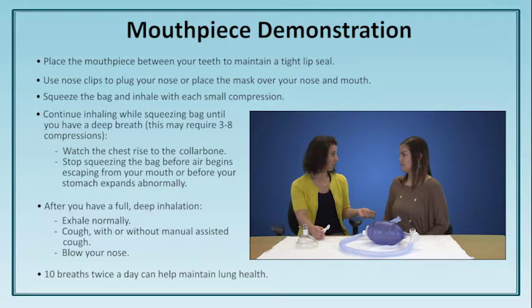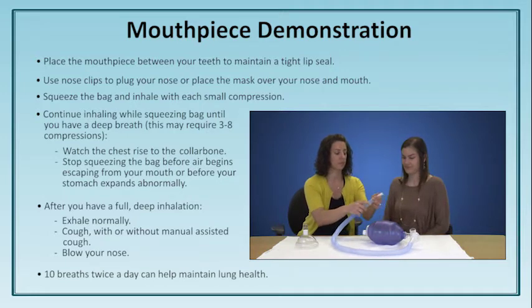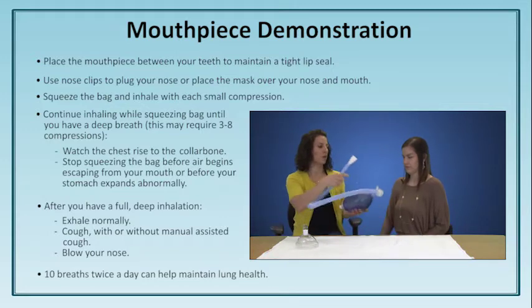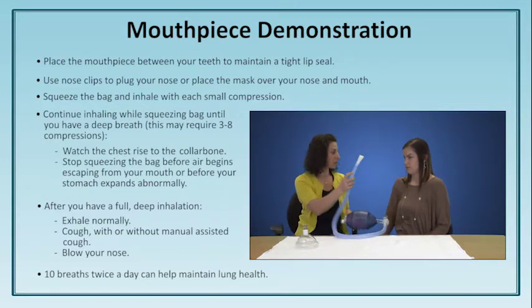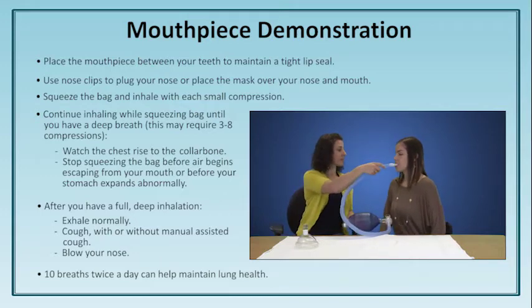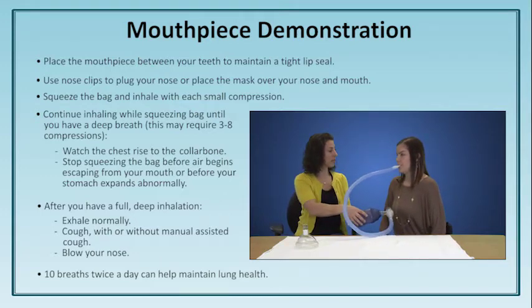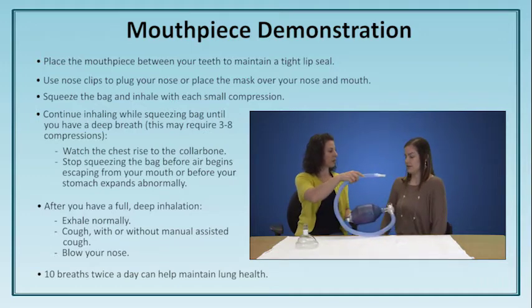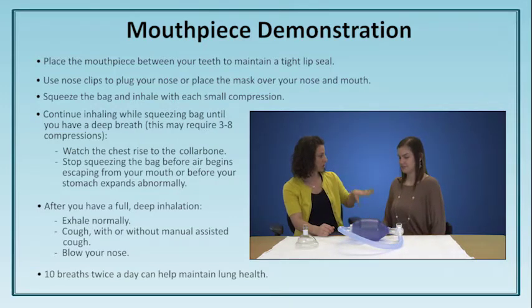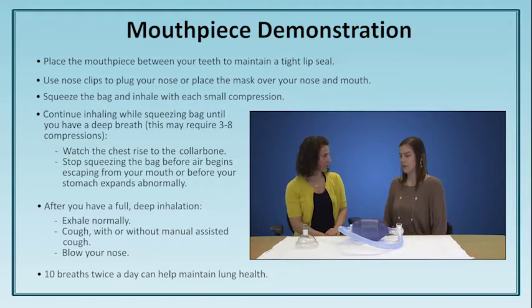Today we're going to try it without nose clips — if you need them you can add them. The indication for needing nose clips is if you feel air coming out of your nose. The mouthpiece goes into the end of the tubing here. You're going to hold the mouthpiece between your teeth and your lips, then just follow my instructions. Breathe in, breathe in, breathe in, breathe in, and let the breath go. Good job — that was about three or four compressions. Did you feel a good chest rise? Yes. How big did that breath feel? Pretty good.